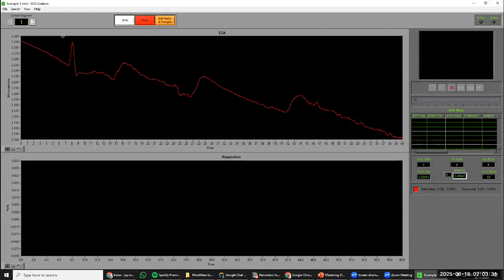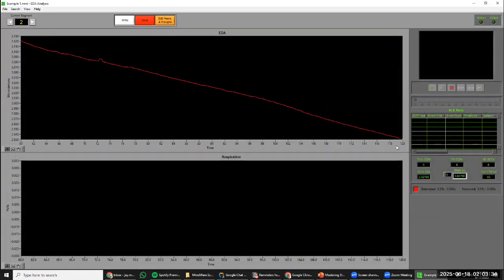Another thing you can look at here is this segment. This is going to be somewhat common, especially in your baseline and recovery periods, where there would be an expectation that they're going to have less of those sympathetic activation periods. So when you see something like this, again, let's look forward. Let's make sure at some point we have some data that makes sense to us in which we're expecting those different changes. But we already did, right? We saw that level change. There is an SCR. This is just typical of someone that is having sympathetic withdrawal, at least at the level of the organ of the skin.